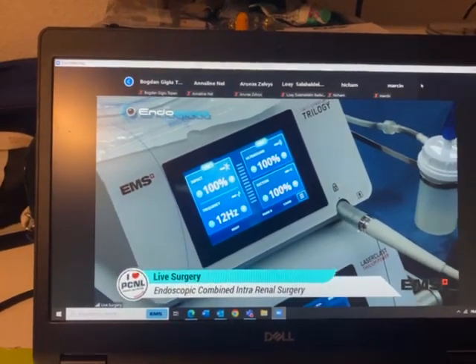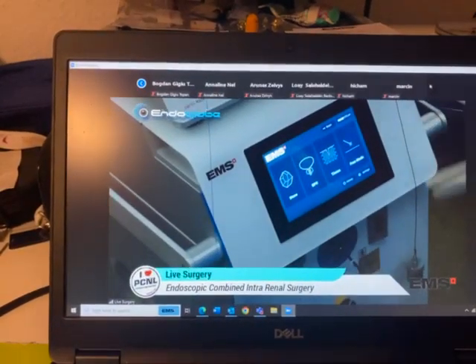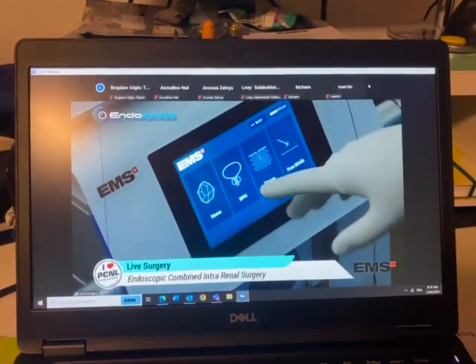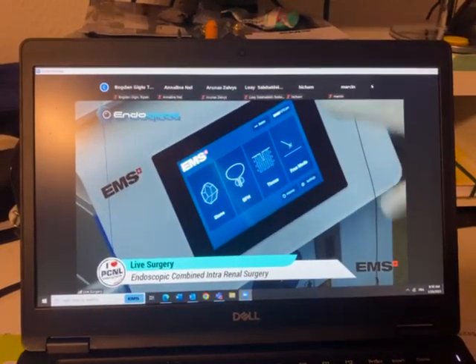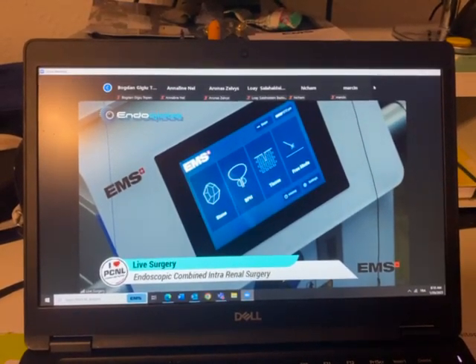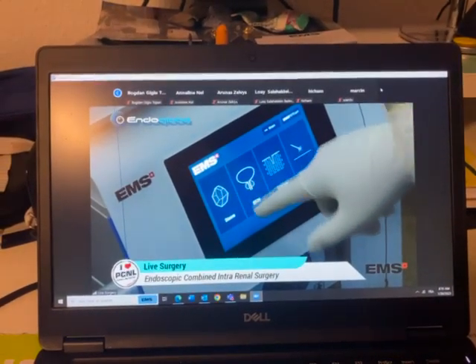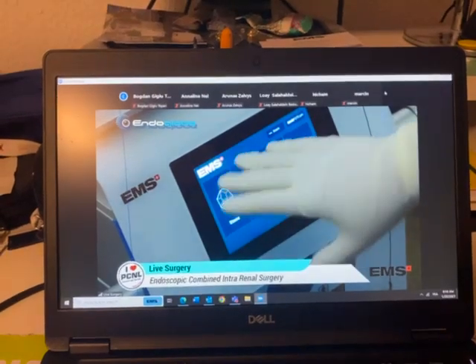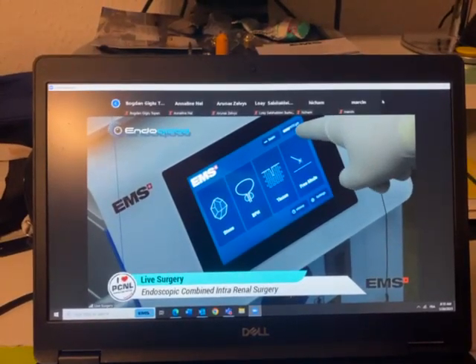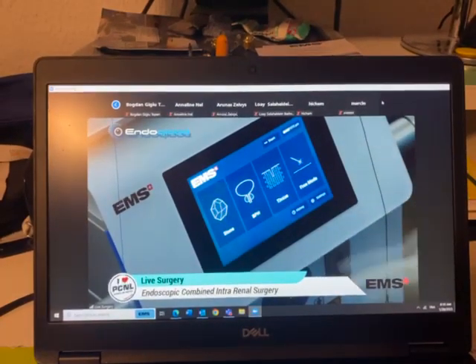Let me show you also lower here. Please show. This is the thulium fiber laser from EMS. It's an excellent device. It's a newly introduced device, very versatile, a lot of different settings. You can do stones, you can do prostates with this. It's one of the devices that I think is also very easy to operate. You can see here that it is already turned on. The fiber that we have now is 270. There are also smaller fibers. There are larger fibers, depending on the use that you are going to have.